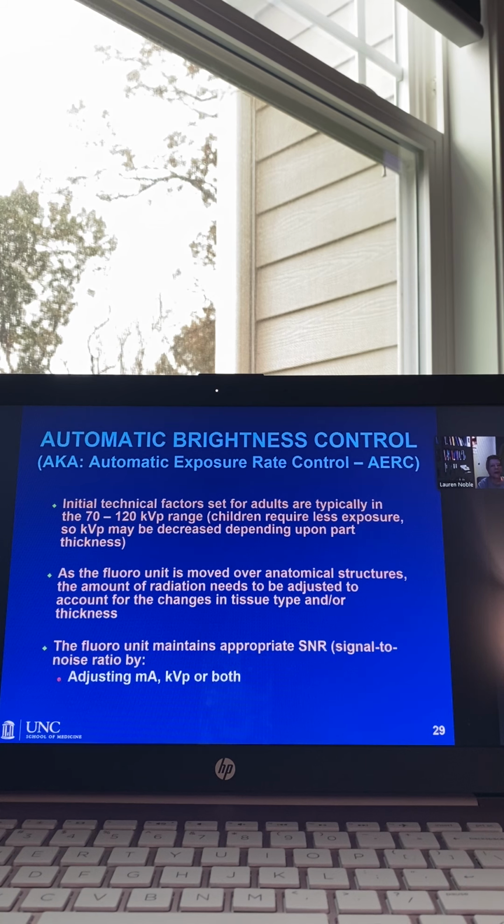All right. And you will find on that flat panel detector system the same type of buttons in terms of, there will be a button for mag mode, there will be collimator buttons, that type of thing. So you're going to have those similarities there.